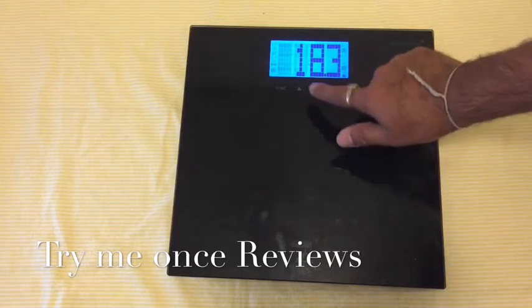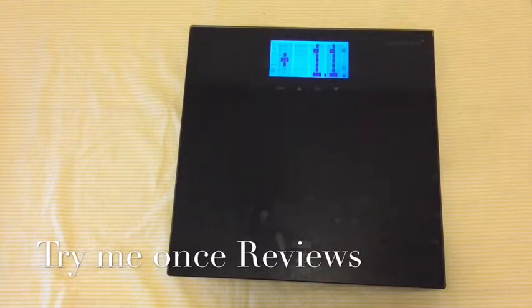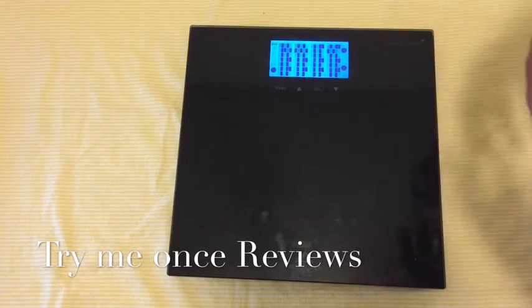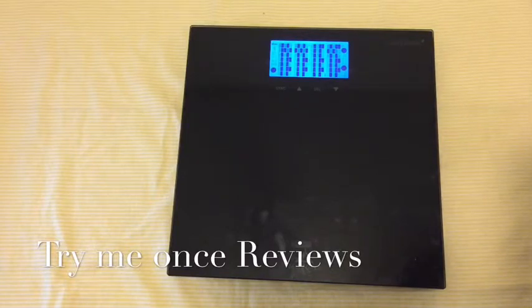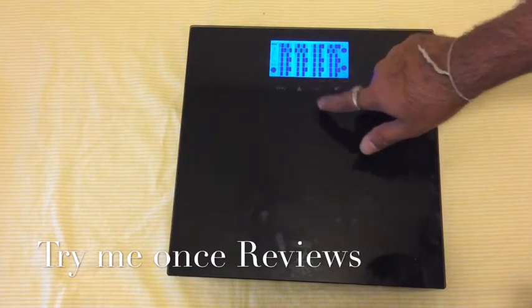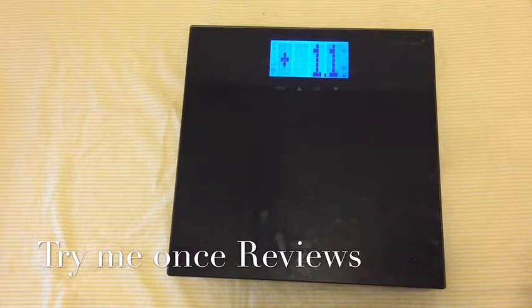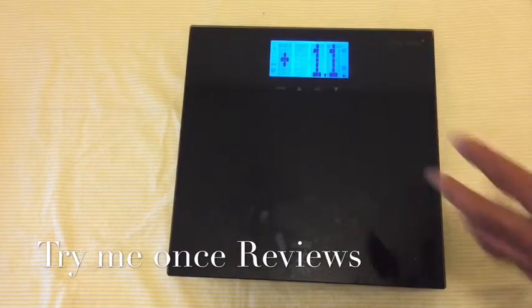The weight now shows 18.3. The other good feature is the weightless mode — you can see a plus 1.1 indicator. This basically means it doesn't show you the exact weight if you don't want it to; you can just see the difference in weight. When you're following a daily routine and tracking your weight, you don't need to remember yesterday's weight — it will simply tell you. So the weight is 18.3, but there's a difference of plus 1.1 pounds.